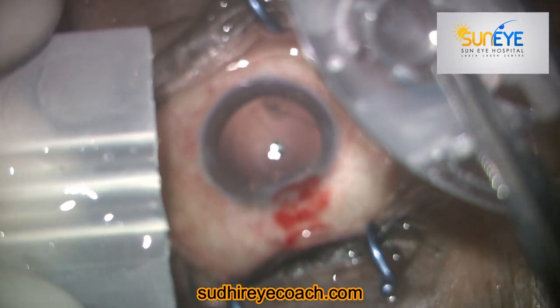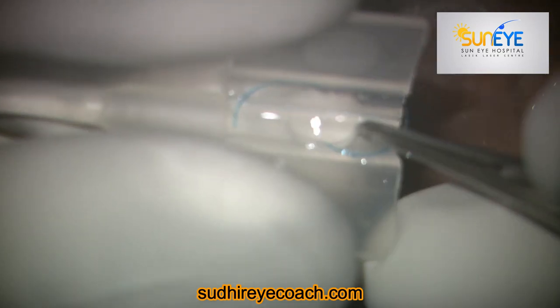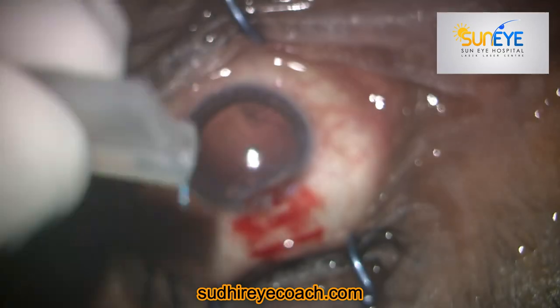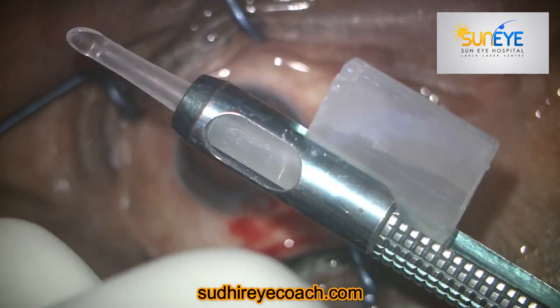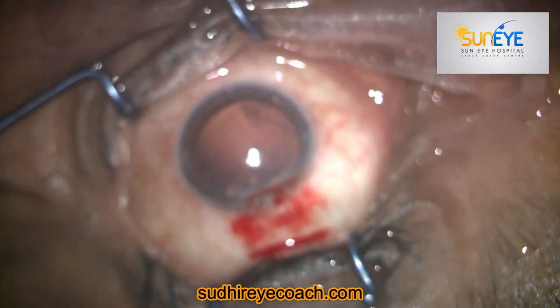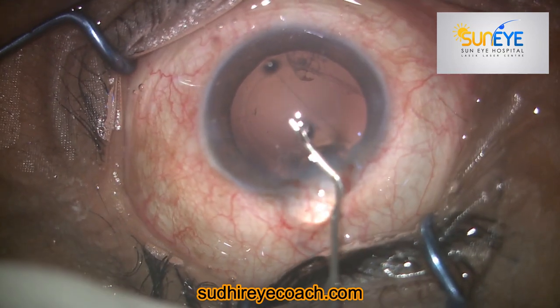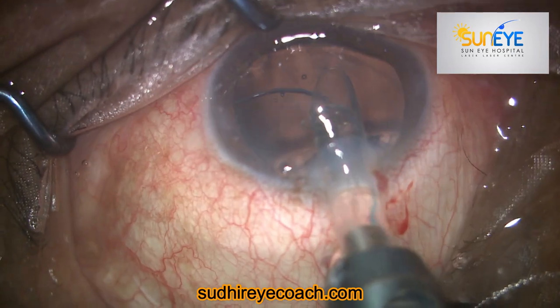Then I changed the strategy. This is the time where you have to control your nerves — just be patient and always keep multi-piece hydrophobic implants ready in your theater. It is not recommended to implant single-piece hydrophobic lenses in the sulcus because they are thicker, and placing them in the sulcus will definitely create problems post-op — the patient will have low-grade uveitis because it will rub against the back surface of the iris. So here I implanted a multi-piece IOL in the sulcus.